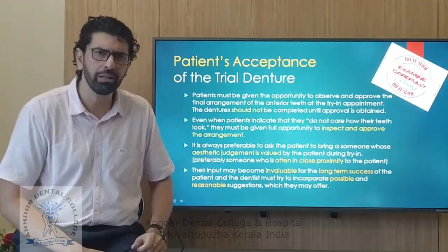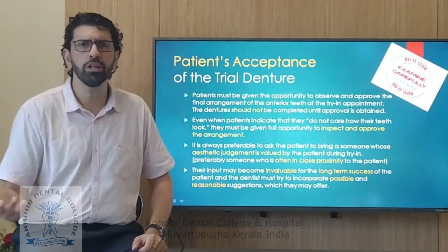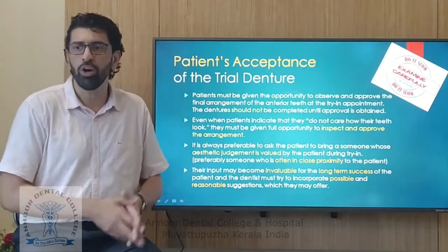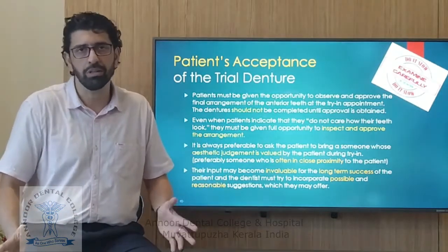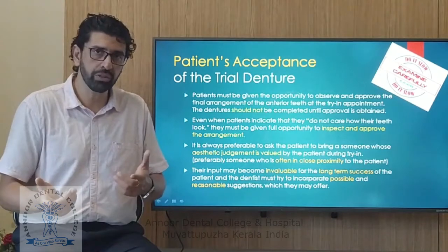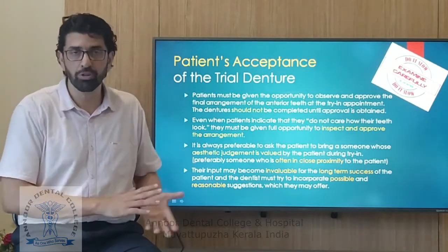Most places, I think it's now mandatory to get a signed approval form, because once you process it, there's no going back. There's no going back and saying, oh, you should have told me before, or the patient says, that's not what I like, this is what I liked. It just doesn't work. So make sure you get it approved. Make sure you take some trial denture photographs in front of the patient, so the patient is happy, and you can always refer back to them.